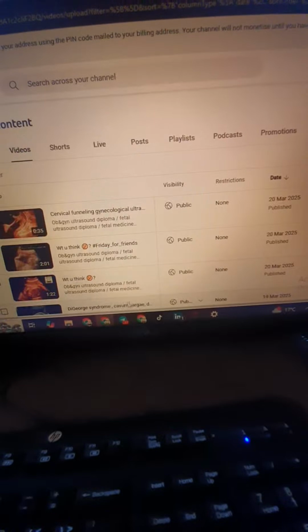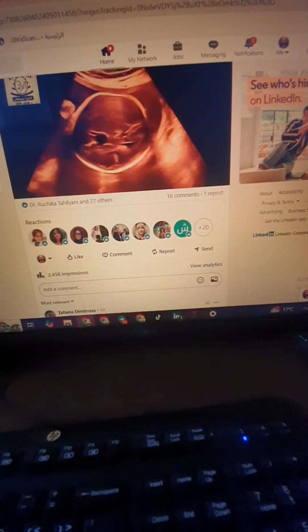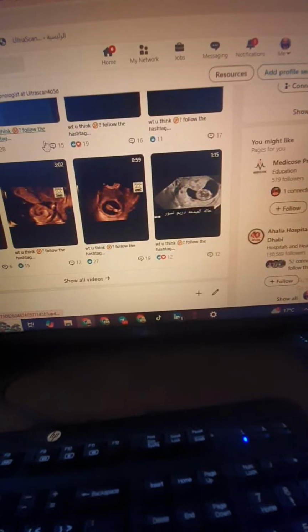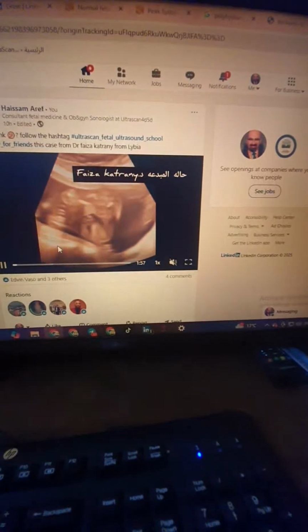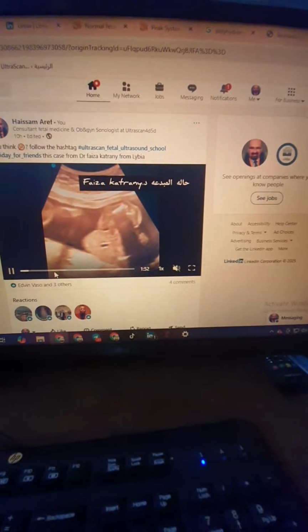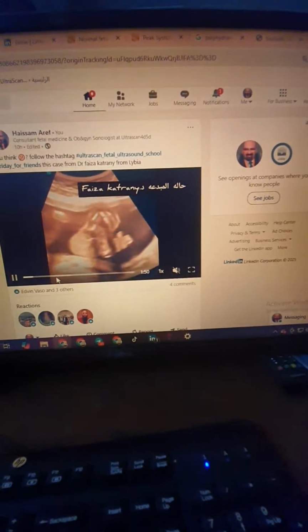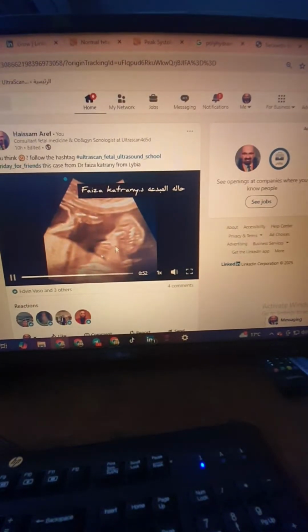Okay, let's go back to our final case for this week, which will be, like we have said, Friday for friends. You can send me your case if you are willing to. This week's case is from Dr. Faiza Katrani from Libya, and she is demonstrating what we call the pentalogy of Cantrell. It's the same as the limb body wall complex, but with the heart outside. With the heart outside, my friends, like this.